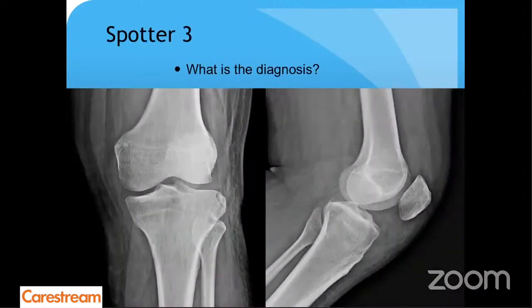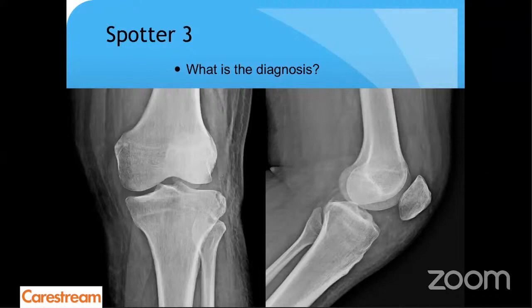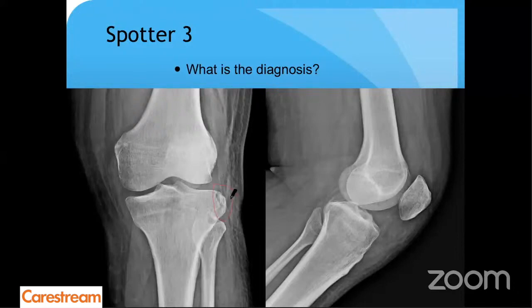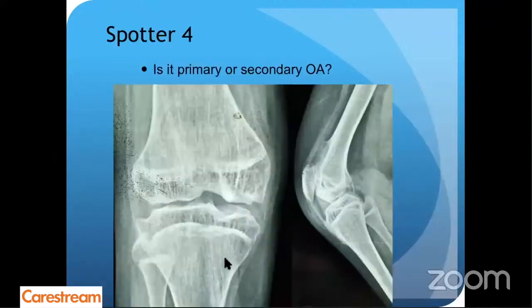Next — what is the diagnosis? This is a very subtle finding; if you go through your format, you'll find it. Be specific. Time's up. So this was a Segond fracture, which means that this patient had or has an ACL injury.